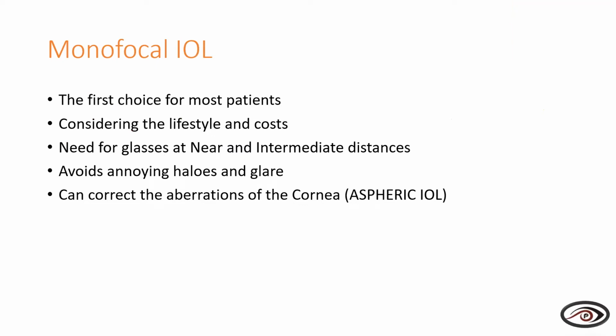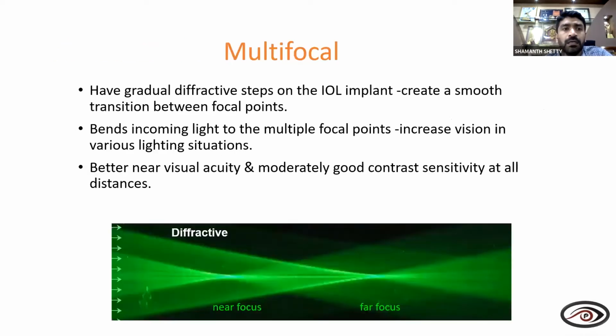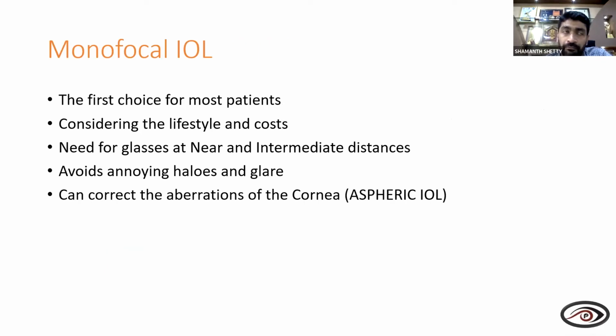Now coming to the other options that we already have, monofocal is the most widely used, mainly because considerations of lifestyle and cost come into play when we make a decision for the patient. As we know, monofocal is the cheaper option for the patient, and the multifocal, the trifocal, and the extended depth of focus or enhanced monovision are all more expensive. There are a lot of advantages in the monofocal as compared to a multifocal, as most of our monofocal patients do not have many complaints compared to our multifocal patients, because it's a very simple technology. We are not playing with the brain or asking the brain to do more than what it is usually accustomed to do.